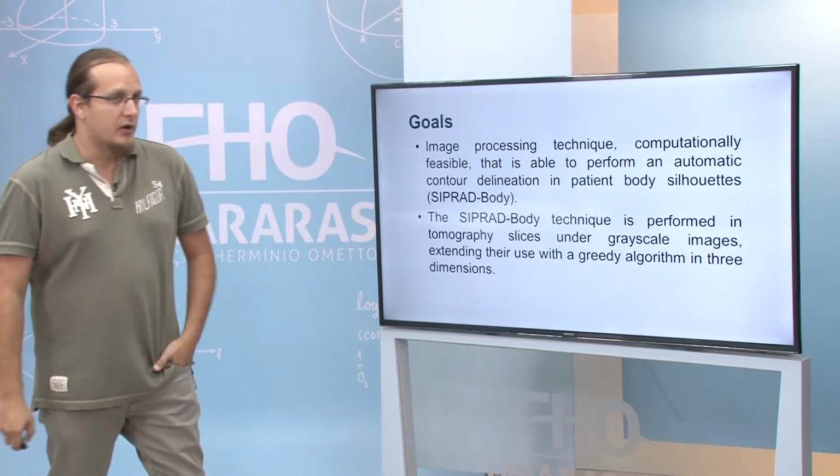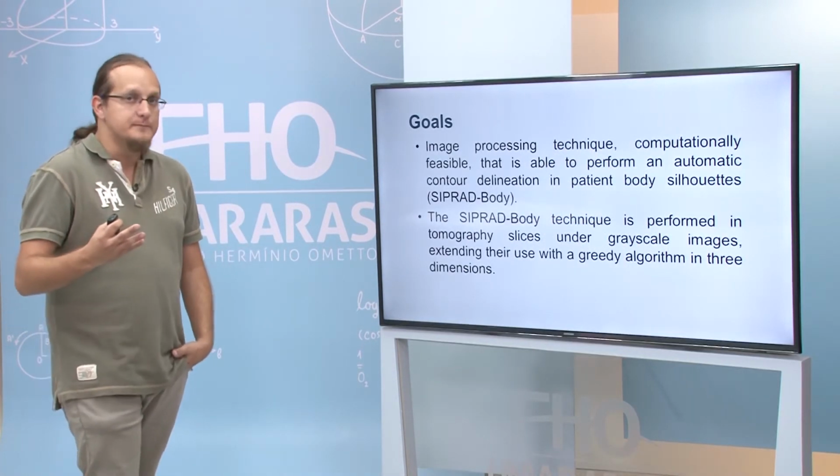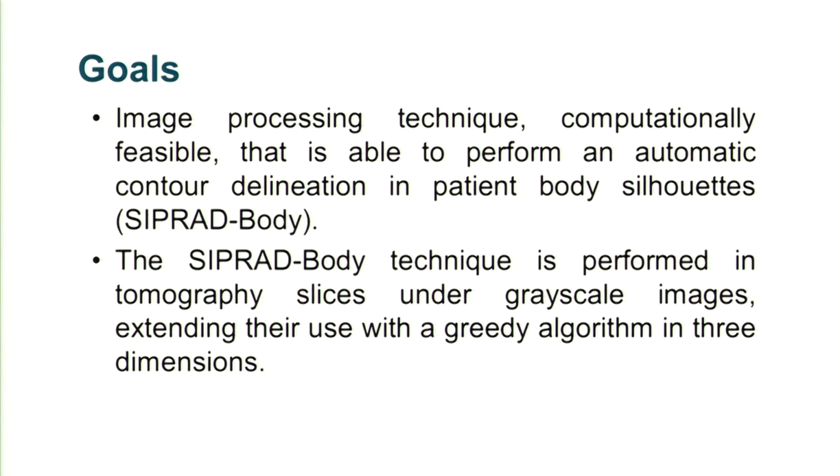Well, the goal of this project is a computationally feasible image processing technique that is able to perform automatic contour delineation in patient body silhouettes, named SIPRAD body.